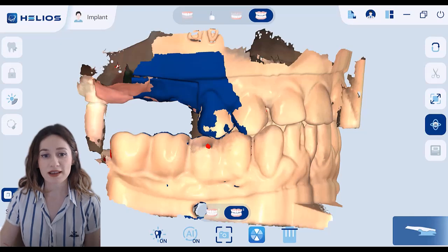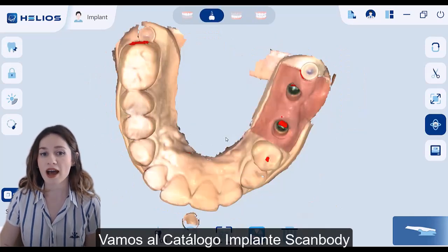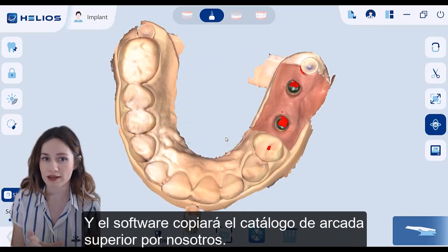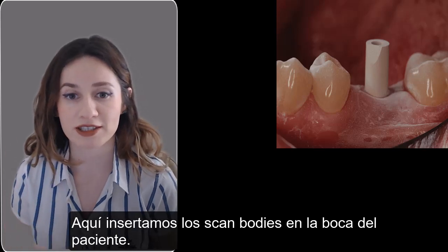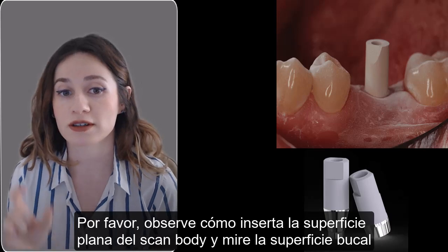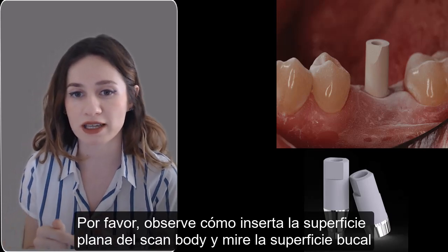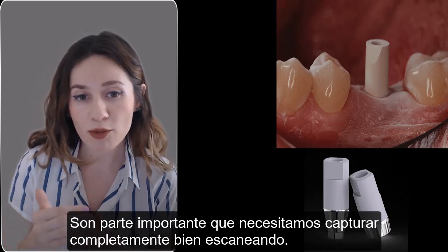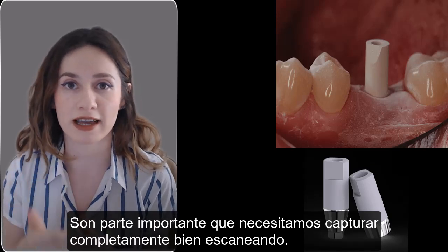Fifth step: select the implant scan body catalog, and the software will copy the upper jaw catalog for us. Here we insert the scan bodies in the patient's mouth. Please watch that the flat surface of the scan body faces the buccal surface — this is an important part we need to capture completely in scanning.